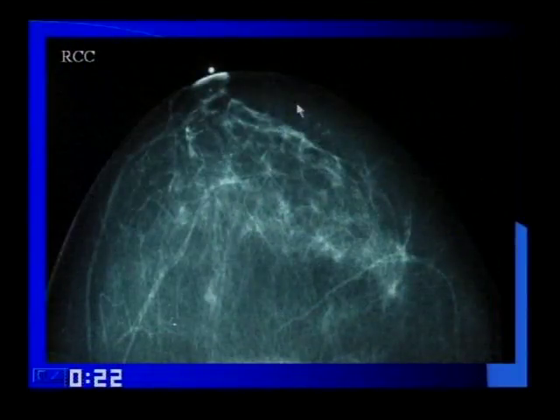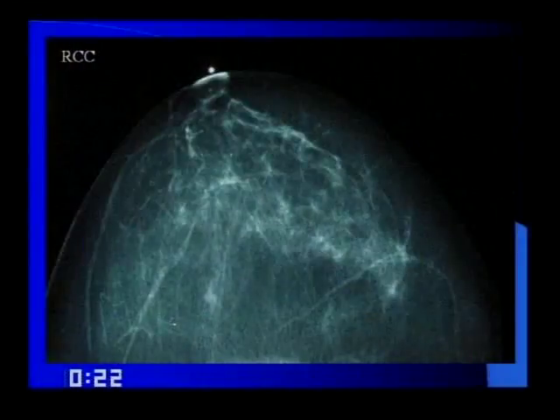Now, on her regular mammogram, this is all fat. The skin is focally thickened right here, just at the nipple. There's not a lot of increased density throughout the breast. An inflammatory carcinoma is an edematous process because of lymphatic obstruction, and the breast is markedly dense with markedly thick skin diffusely over the entire breast. So this is not the pattern of an inflammatory cancer. It is the pattern of Paget's disease of the nipple.